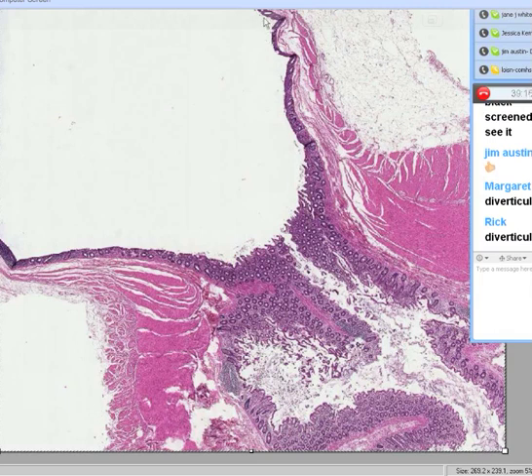How many of those 4 layers are in the diverticulum? You see some mucosa, you see some submucosa, you don't see much muscularis at all, maybe a tiny bit. And then you see some pericolonic connective tissue, which you might want to call adventitia or serosa.